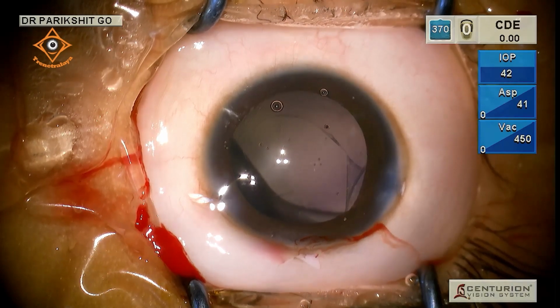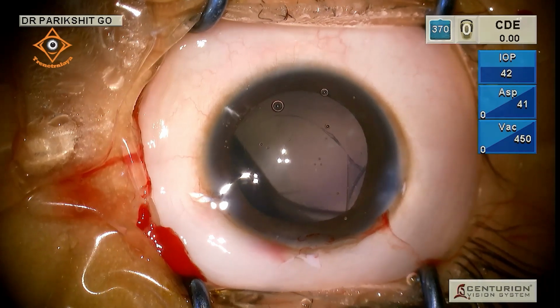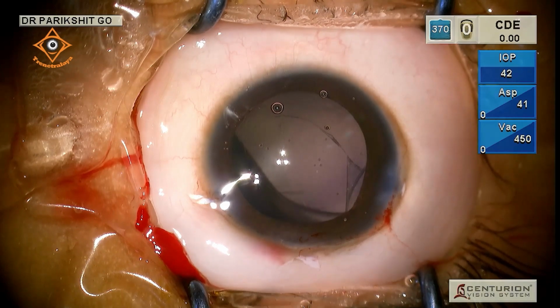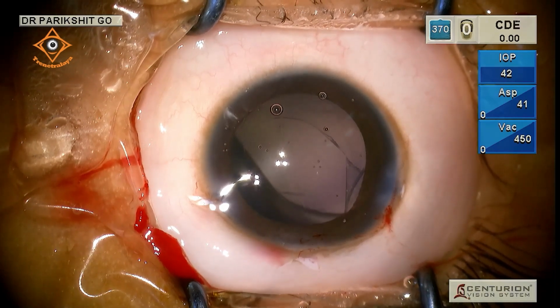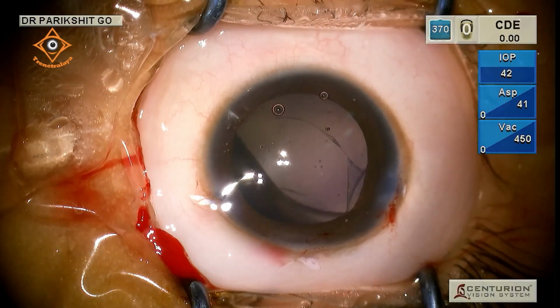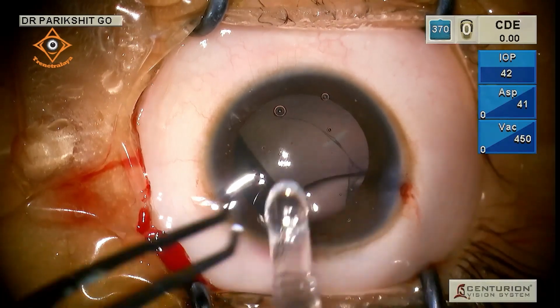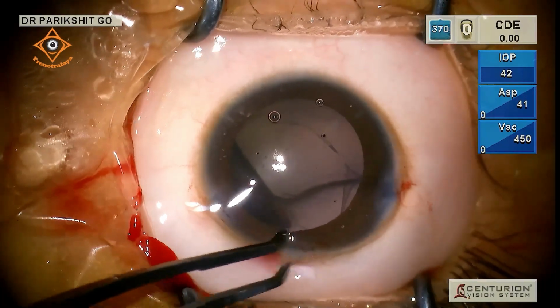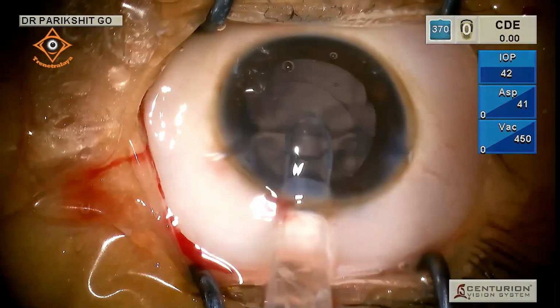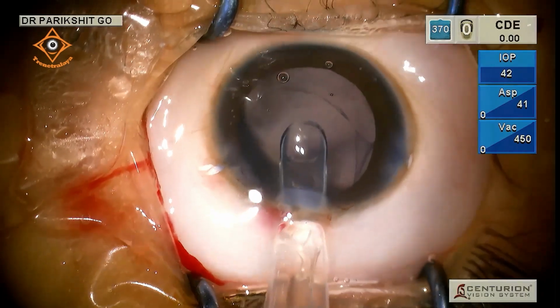So this child, when we do it, he will be just slightly hypermetropic, and because the child is less than 2 years old, as this child will grow, this child will become myopic at some point of time. But then even if the child is myopic, the child will be able to read, write, do all the near work, and nowadays, play on the mobile without putting on specs. And later perhaps we can think of a piggyback lens or a lens exchange. And God knows what technology is going to come in the next 10 or 15 years when this child becomes adult.